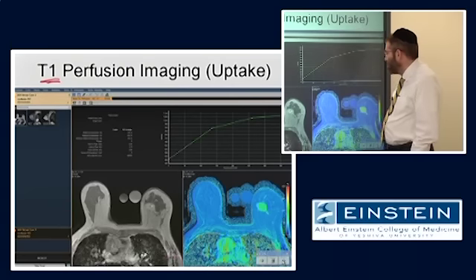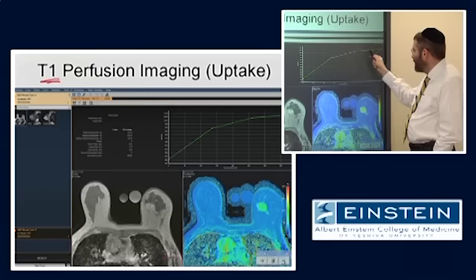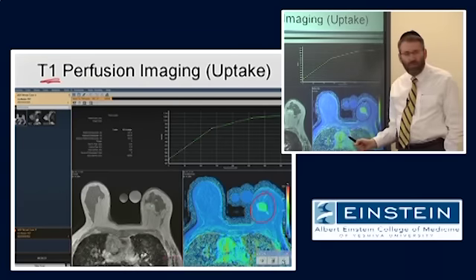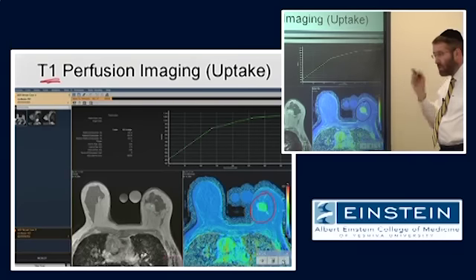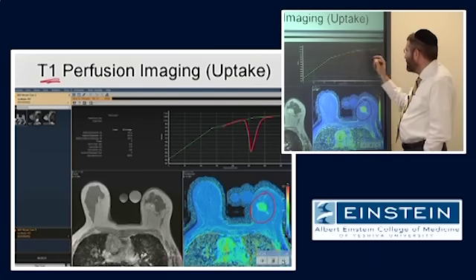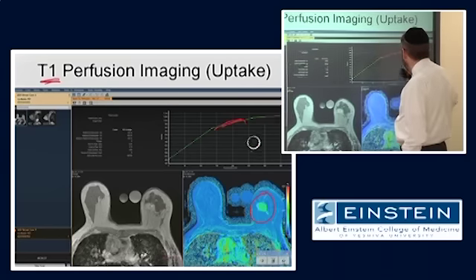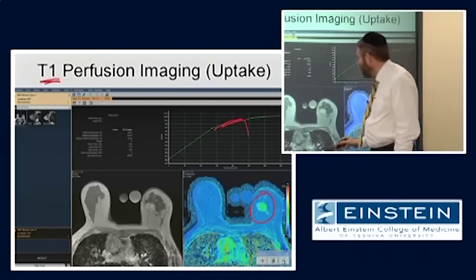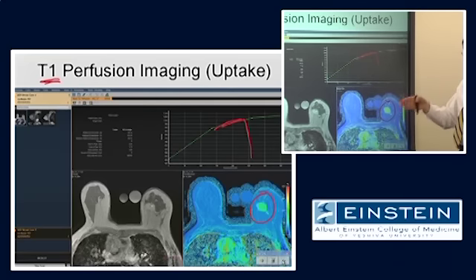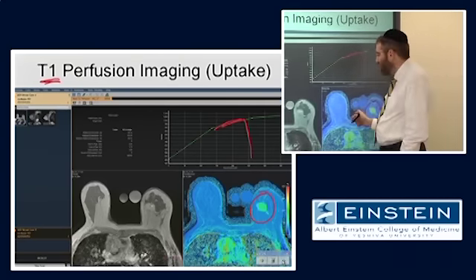this T1 perfusion change in the breast, and this appearance of a gradual uptake and a persistent plateau, right, is supposedly suggestive of benign lesions as opposed to malignant lesions, which have more of a large uptake and a rapid fall off in their T1 related signal. So it's the same idea of watching this, right, in a temporal manner, but it's not the same sort of real-time approach to imaging.